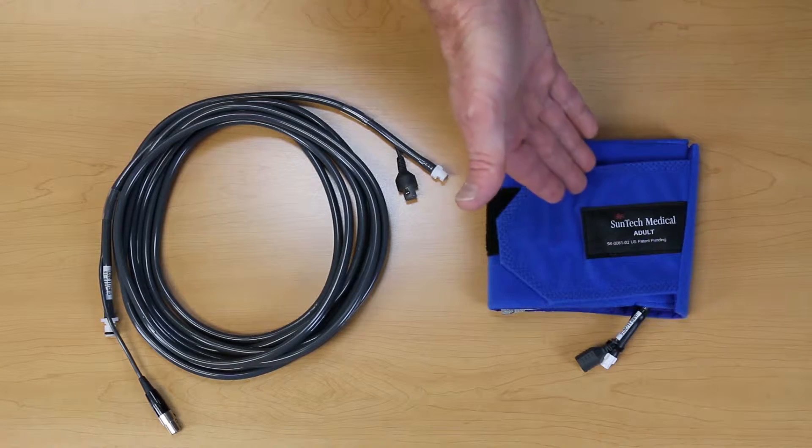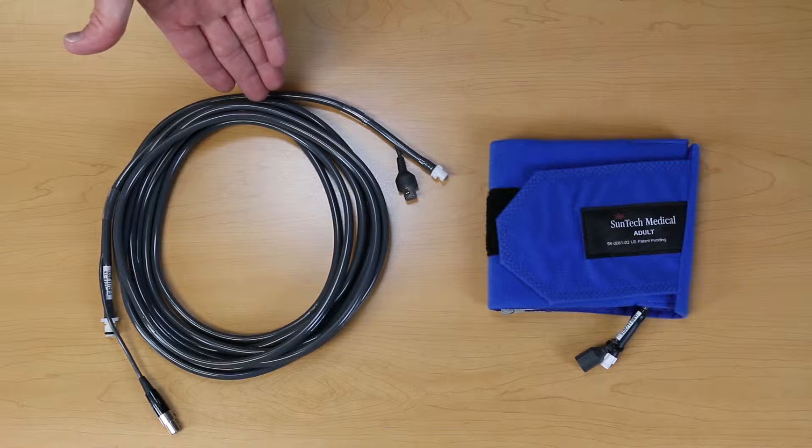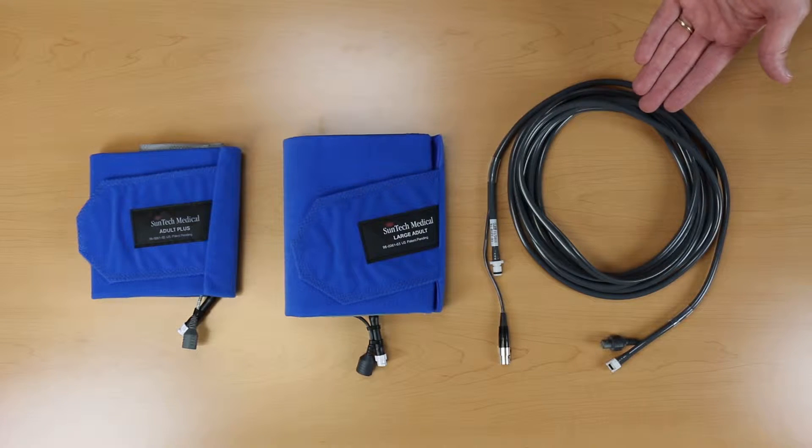Please keep in mind that the Orbit K-Cuff, K-Sound microphone, and gray patient cable should be replaced annually. Suntec makes a preventative maintenance kit for the Tango M2 that includes everything you need.